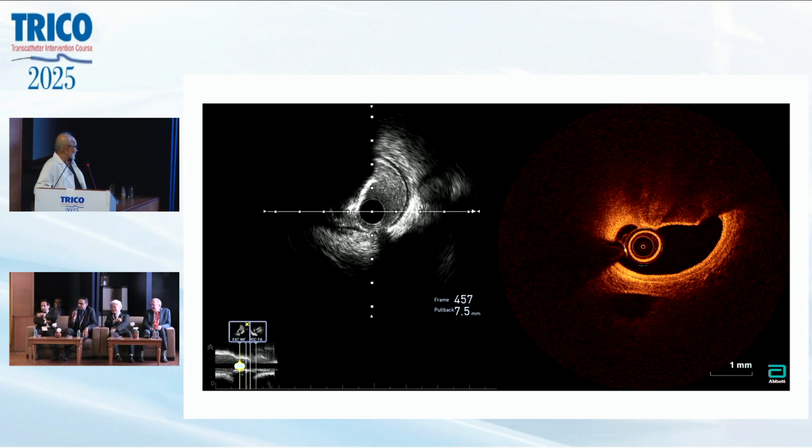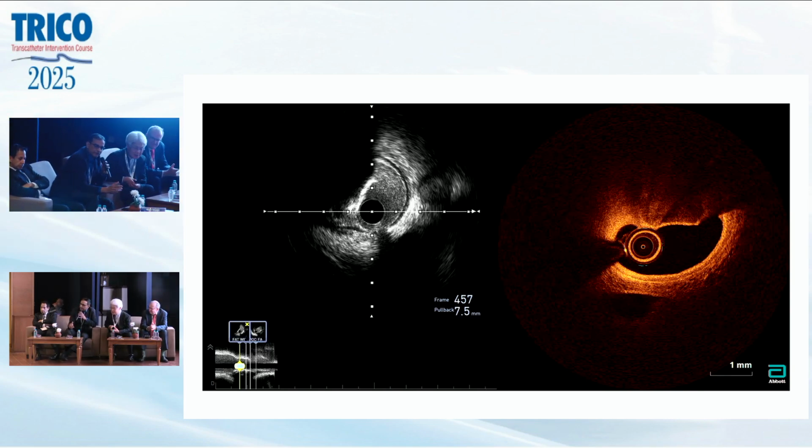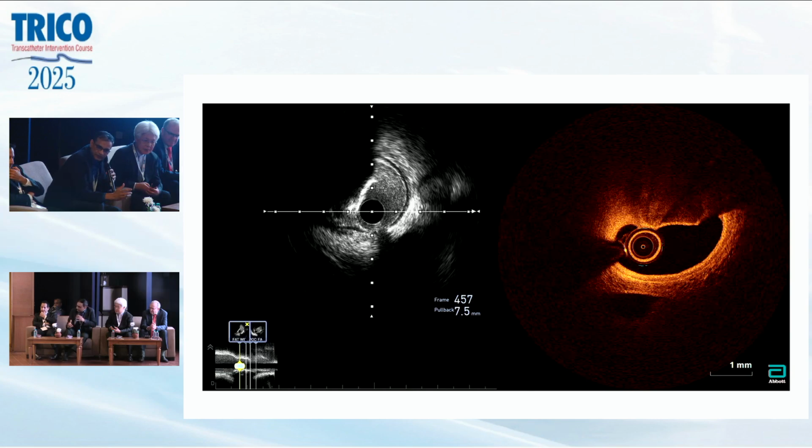So I think multiple tools are there. Since it's eccentric, it's a problem. We have a publication where we used IVL for calcified nodules. The problem was it worked sometimes and it didn't work, and we still don't know when it works and when it doesn't work. We just put it in and then hope that it works.